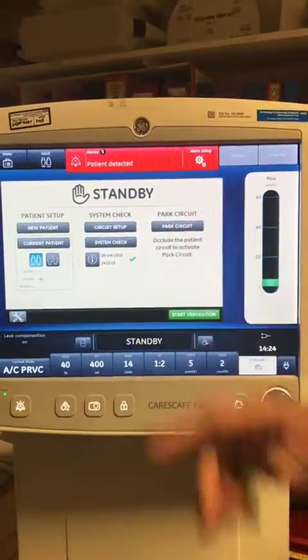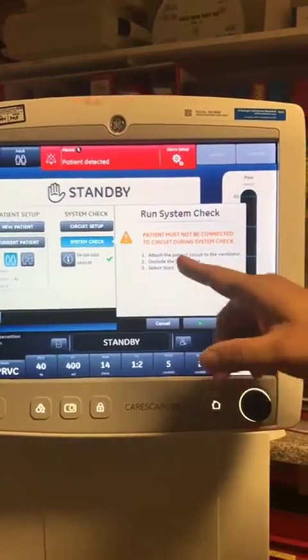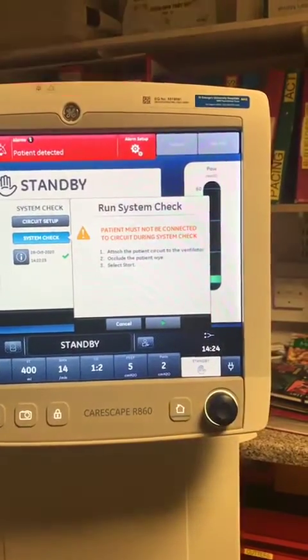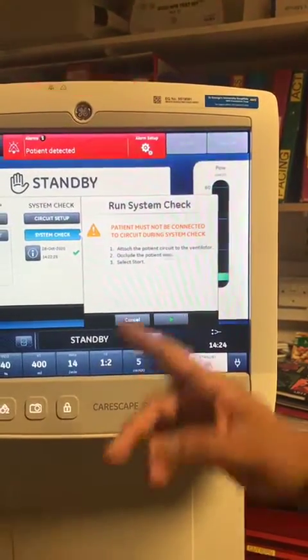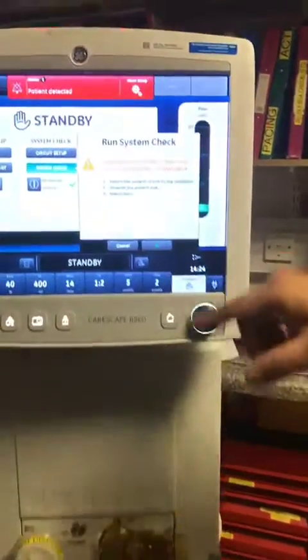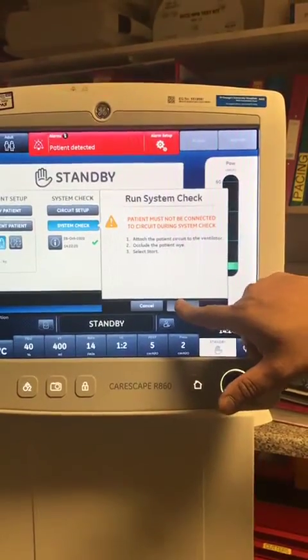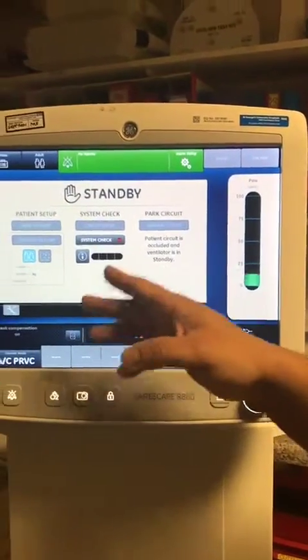Once you confirm that, go to system check. It says attach the patient circuit to the ventilator, which you've already done. You've got the red bung which is occluding the patient circuit. Then you have to press start — it doesn't have a start button, so you press the play button. Play means start. Press it and it goes into a self-check.